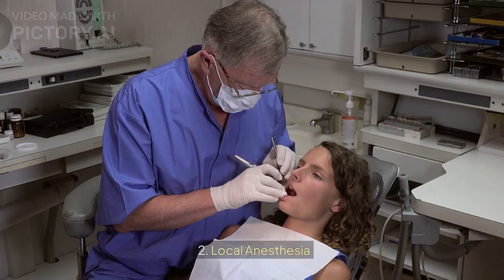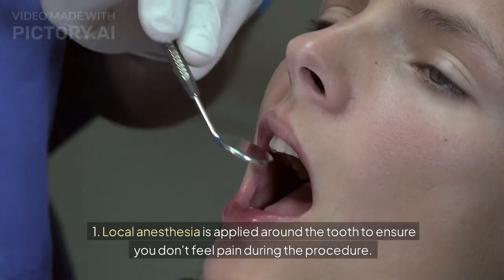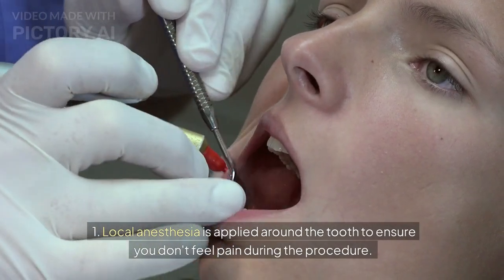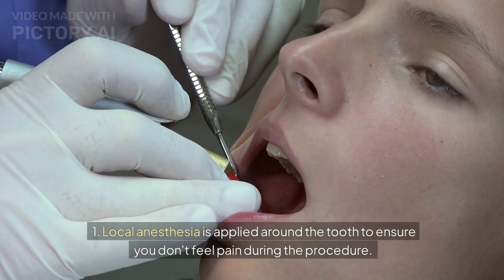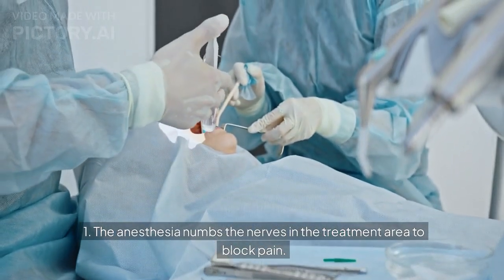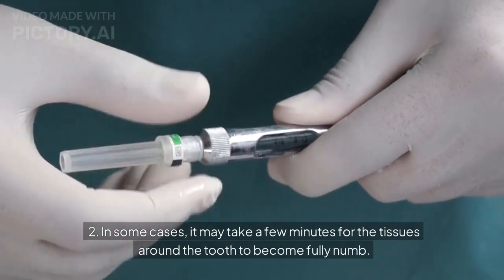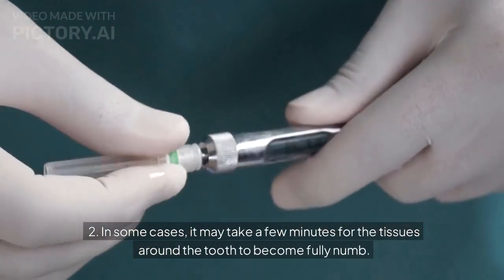2. Local anesthesia. Application of anesthesia. Local anesthesia is applied around the tooth to ensure you don't feel pain during the procedure. The anesthesia numbs the nerves in the treatment area to block pain. In some cases, it may take a few minutes for the tissues around the tooth to become fully numb.